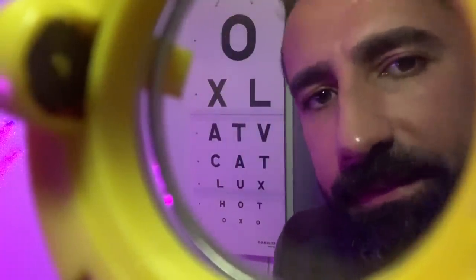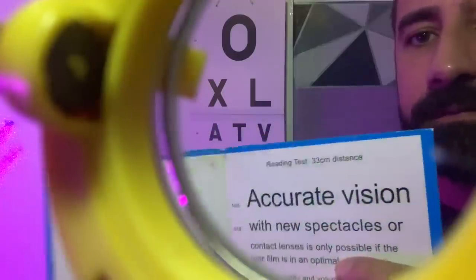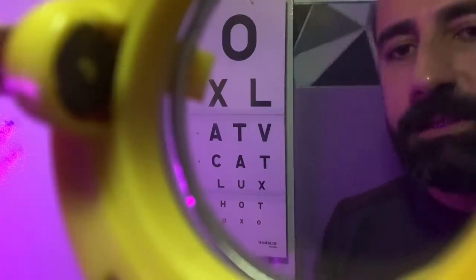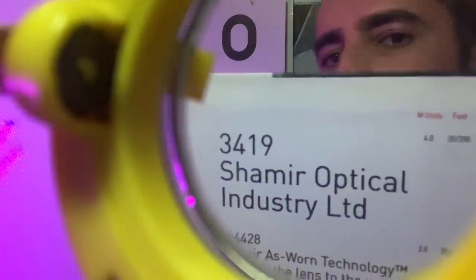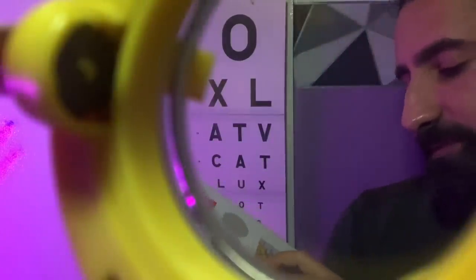Now we're going to do a little near vision test with some more with or without the lens. To use this little test chart here up close. Okay, I need to know what is the smallest print you can read on the page for me, please. Excellent. Okay, let's move on to the next near vision chart. I have the Shamir near vision chart. A little bit different, more specific text. So what is the smallest print you can read down to, please, on the chart? I think it's very small at the bottom. Okay, so maybe here, just about. Excellent. So we have a size of N5.